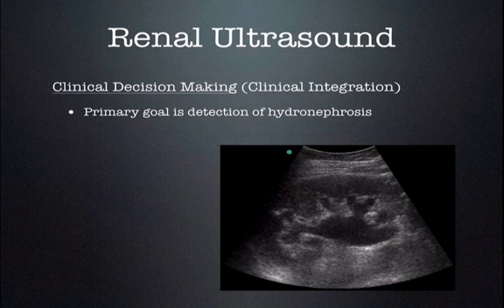The primary goal for point-of-care renal ultrasound is for the detection of hydronephrosis. If you remember nothing else about this lecture, I promise it will be that.